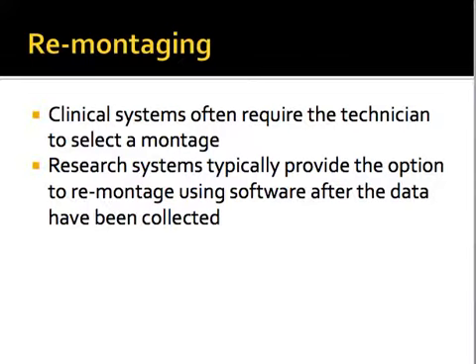Sometimes you will acquire data in one way and then discover later that, for whatever kind of analysis you're doing, you wish you had acquired data in another way. If you're in a clinical environment, you're often out of luck, because most clinical systems require that the technician selects the montage. This does not mean that you physically rearrange the probes. It means before you record the data, you tell the system what your montage will be, and then it records it under that particular arrangement.